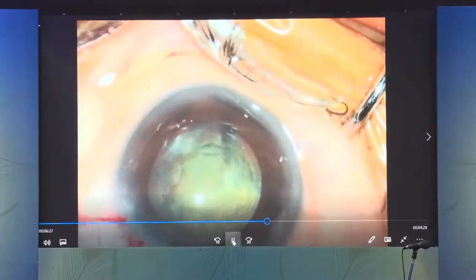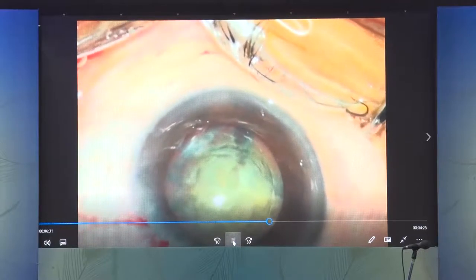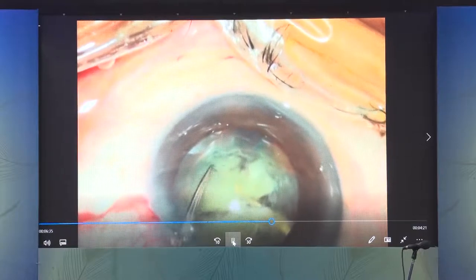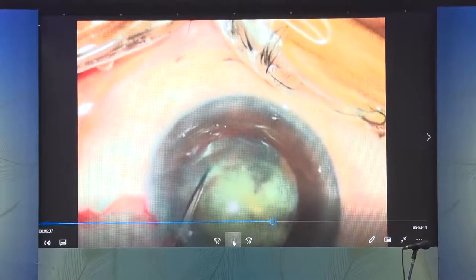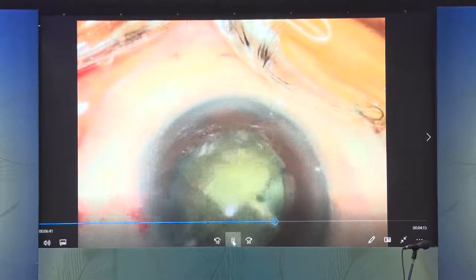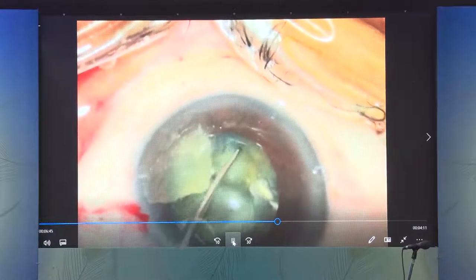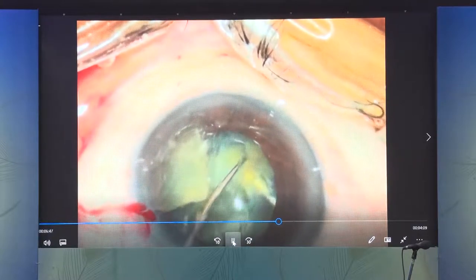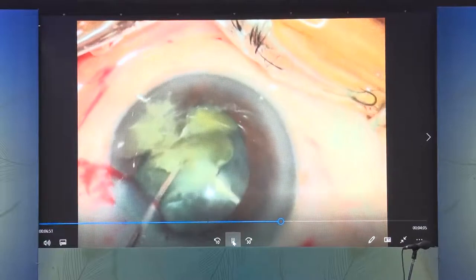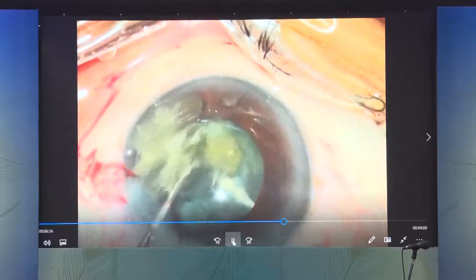Another mistake — in this video from over six years ago — a 26-gauge needle was introduced into the bag with a view to trying to save fragments and bring them up. Today I would state this is definitely a no-no. Any introduction of a needle to try and save the nucleus from going down is going to cause significant damage to the vitreous base, with the propensity of creating holes, tears, a detachment, and macular edema later.